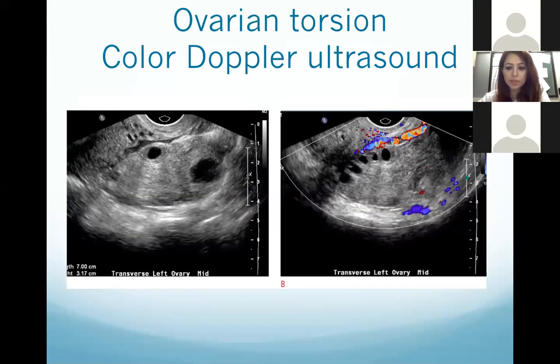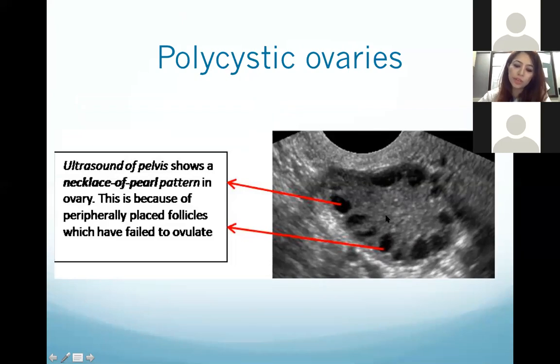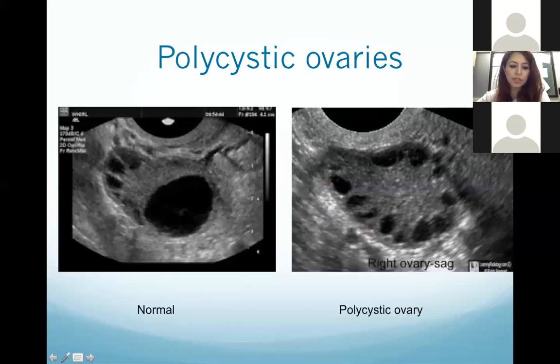This is another image showing ovarian torsion. This image shows polycystic ovaries — the necklace-of-pearl pattern — with multiple follicles of equal size arranged at the periphery of the ovary with a central solid stroma. Here you can see a normal ovary with follicles of different sizes — some small, some medium, some large — versus an ovary with all equal-sized follicles arranged at the periphery.